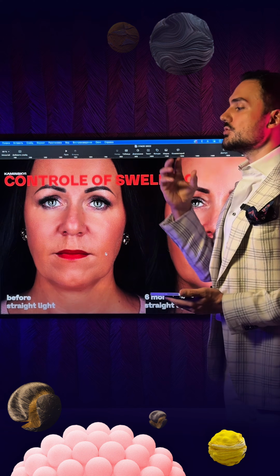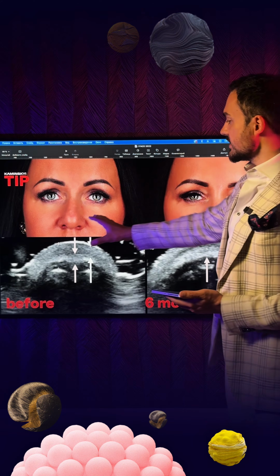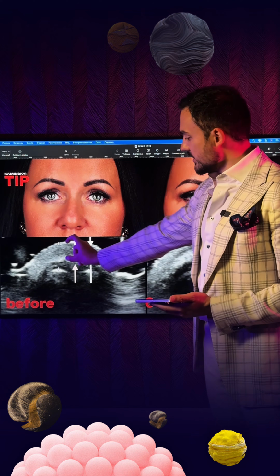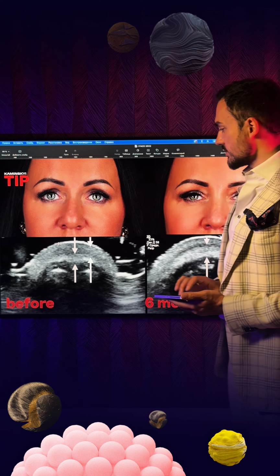Also, ultrasound helps us to understand the thickness of the skin. Maybe we need to treat the skin before the surgery or maybe after the surgery. This is an example of thick skin. You can see the thickness, the distance from the upper layer of the skin to the cartilages.